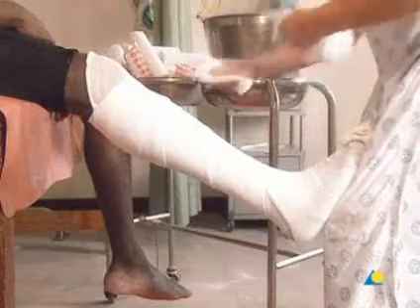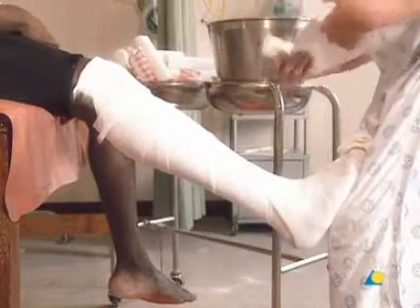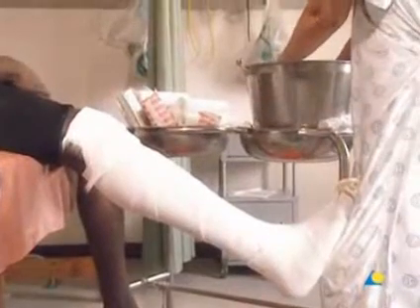A piece of cotton wool is used to pad the patella. It should be kept in mind that when more padding is applied, there will be less support to the injury site. Cotton wool padding is also applied to the heel and over the malleoli to protect against pressure points causing pressure sores. Before the first bandage is wettened, the free end is doubled over to provide additional support for the base of the foot.